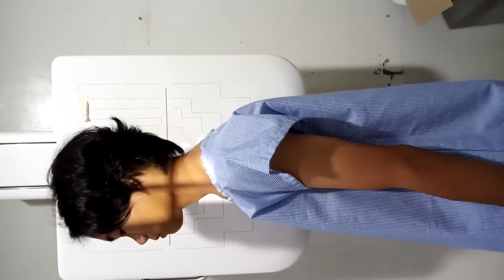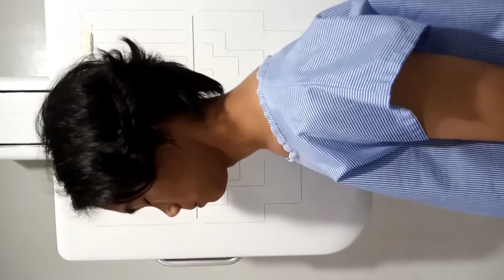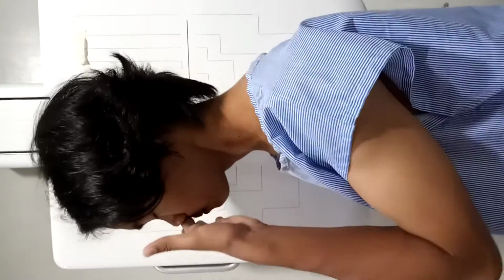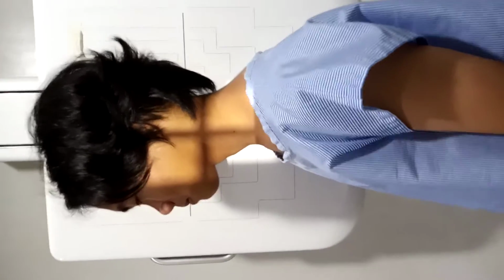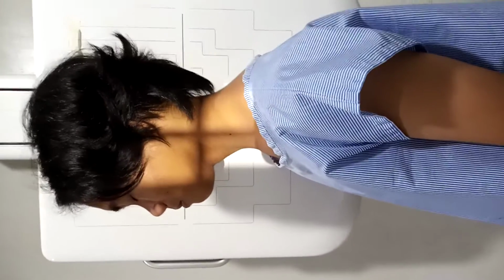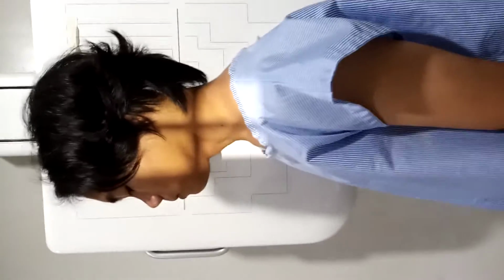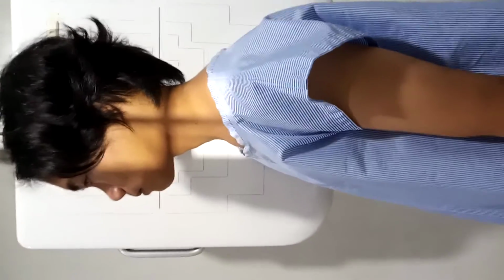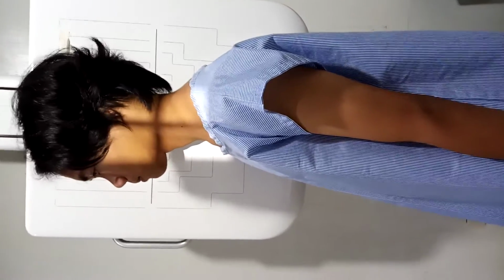In anatomy and criteria evaluation, the cervical vertebral bodies and intervertebral joint spaces, articular pillars, spinous processes, and zygapophyseal joints must be clearly demonstrated. Then in position, the C1 through C7 to T1 intervertebral joint spaces are clearly seen. If the upper margin of the thoracic 1 is not demonstrated, additional images such as cervicothoracic lateral should be obtained.